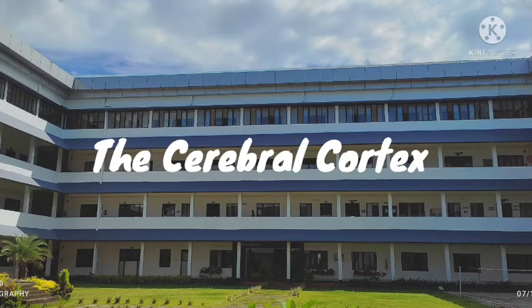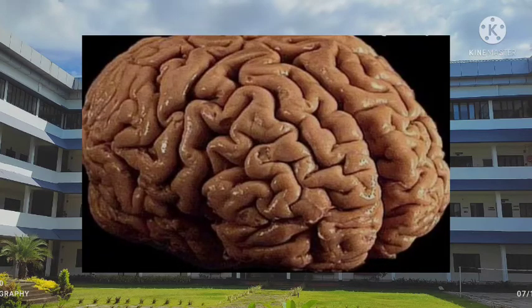Next, the cerebral cortex. The surface of the cerebral hemispheres is not smooth. They show a series of grooves or sulci which are separated by intervening areas that are called gyri. Some sulci are used to divide each cerebral hemisphere into four major subdivisions. Those are called lobes.